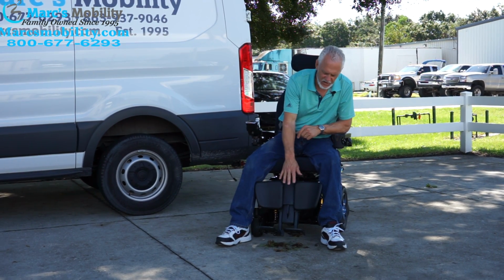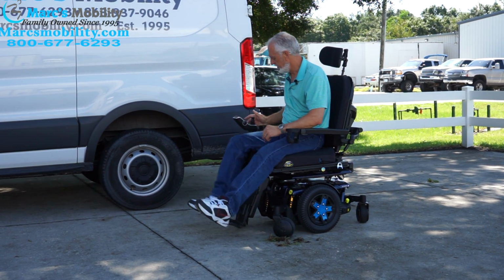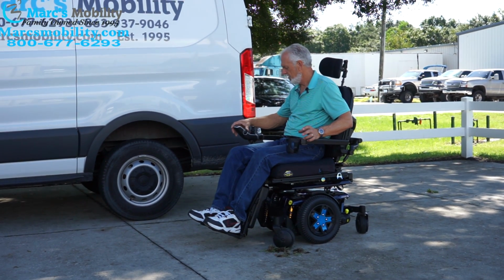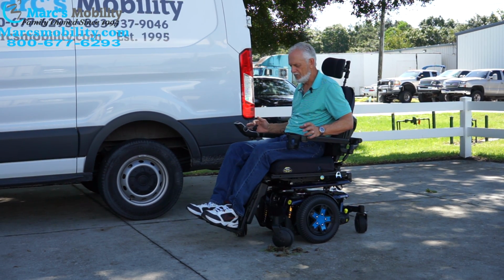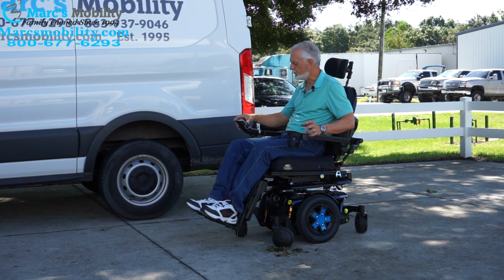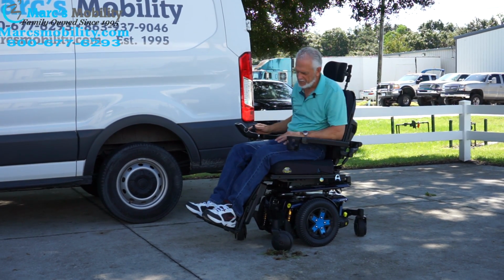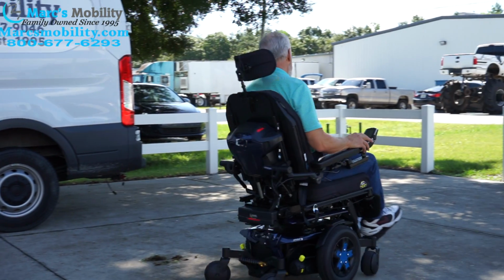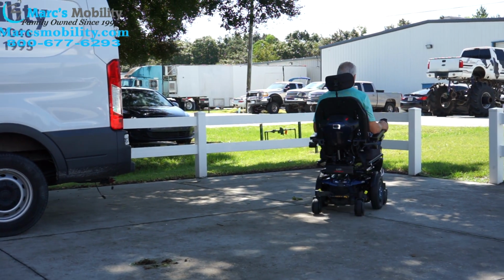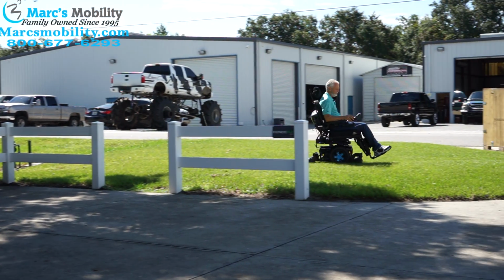So if you're going to drive this chair, the best thing to do would be to do this right here. If you're going to drive somewhere, tilt the seat back a little bit, like I'm doing right now, and you can still drive the chair. Now you got a lot more ground clearance, so when you go through that hump like I just did, you can still drive the chair, but not hit the grass. Like that.